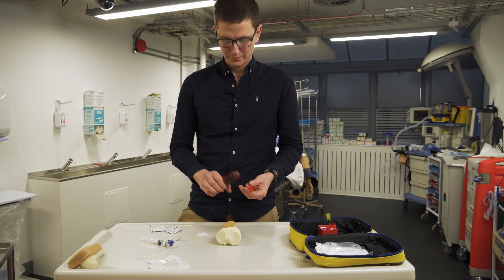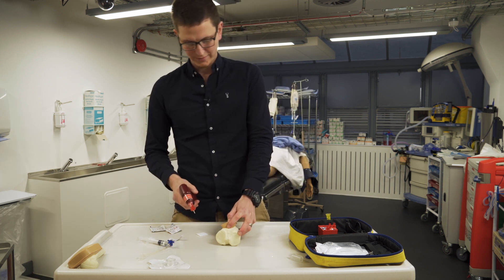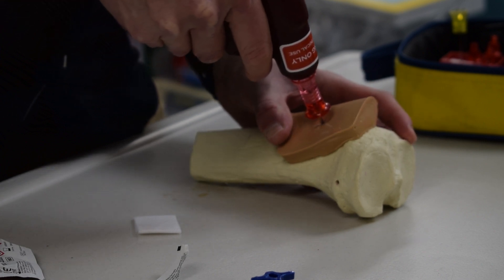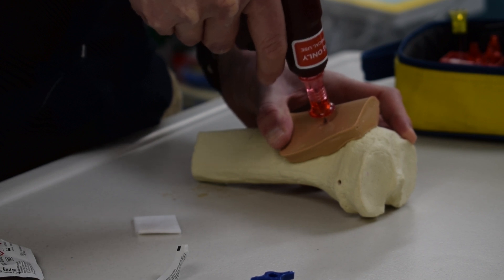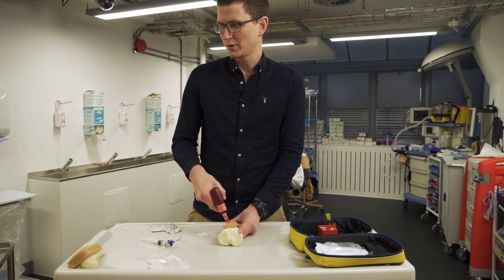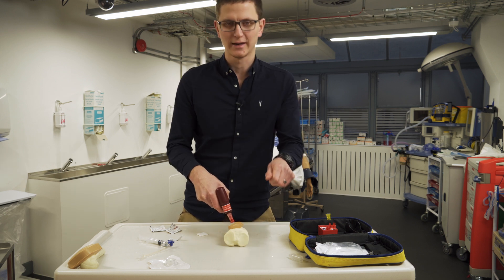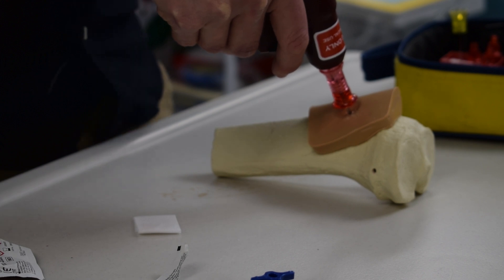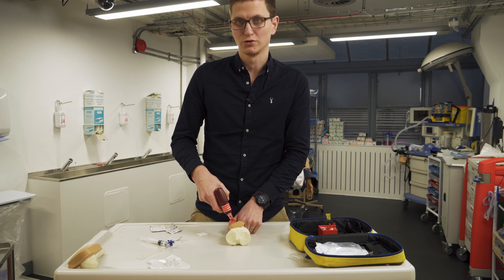The gun works like this - the needle just attaches with a magnet and doesn't go anywhere. We have found our landmark, we're going to go at 90 degrees to the skin, and we're going to push through the skin to the bone. You'll feel the bone - it's hard and rigid. Then you pull the trigger, apply firm pressure, and it drills in. You'll feel a give, kind of like when you're inserting an IV line and feel that give into the vein. We push and feel that give into the middle of the bone, and allow the bone gun to do what it needs to do.